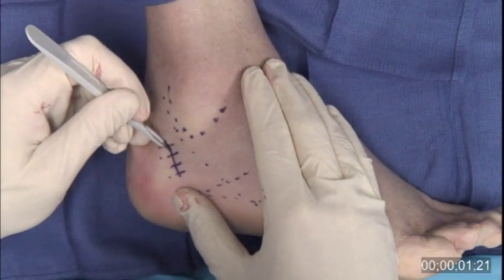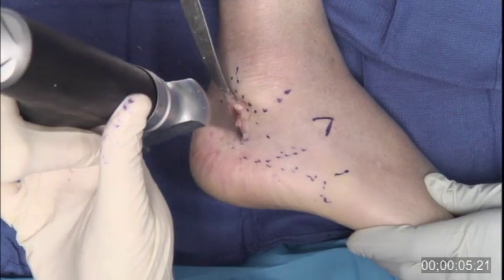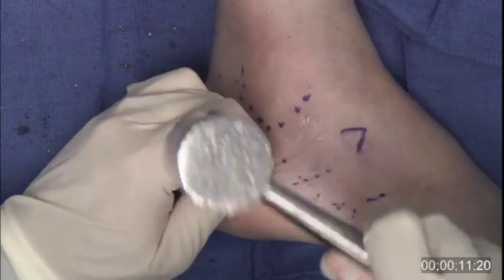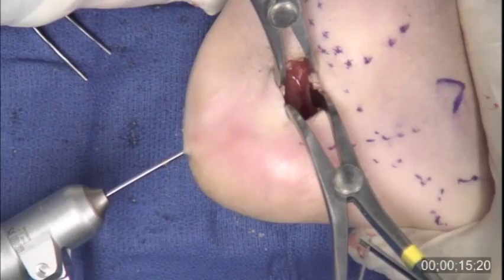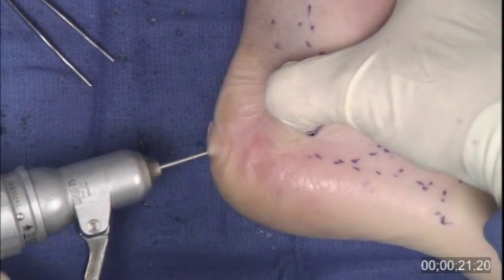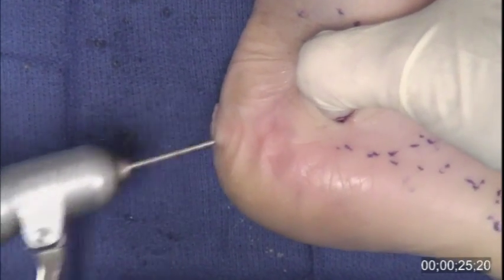The medial displacement calcaneal osteotomy is performed through a lateral oblique incision behind the peroneal tendons. The osteotomy is started with a saw and completed with an osteotome. Laminar spreaders are used to gently stretch the medial soft tissues. Guidewire placement can be visualized through the osteotomy site. The tuberosity is manually displaced about one centimeter and the osteotomy is provisionally fixed.